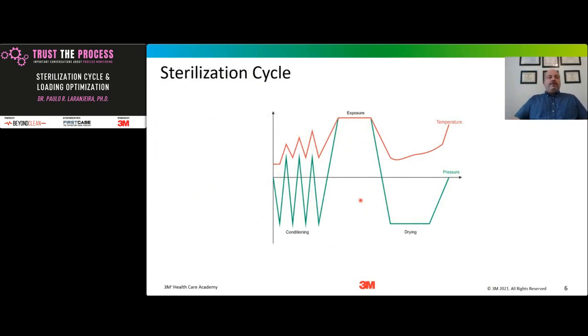So the sterilization cycle, as all of you know, and this is just going back to the basics to make sure we comprehend, I divide it into 3 phases: conditioning phase, exposure phase, and drying phase. In the conditioning phase, I'm going to remove the air from inside of the inner chamber and inject the steam to warm up the load. So I have to remove air and warm up the load. Exposure, I'm going to inactivate the spores, and then at the drying phase, I'm going to make sure that my loads are dry.